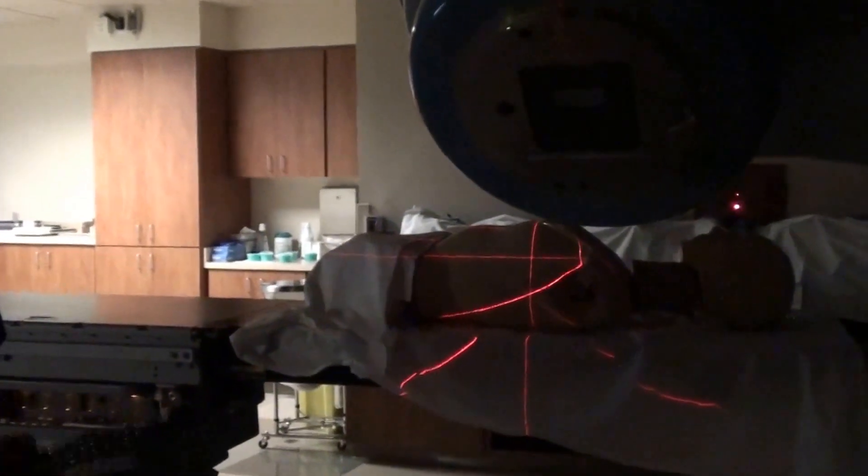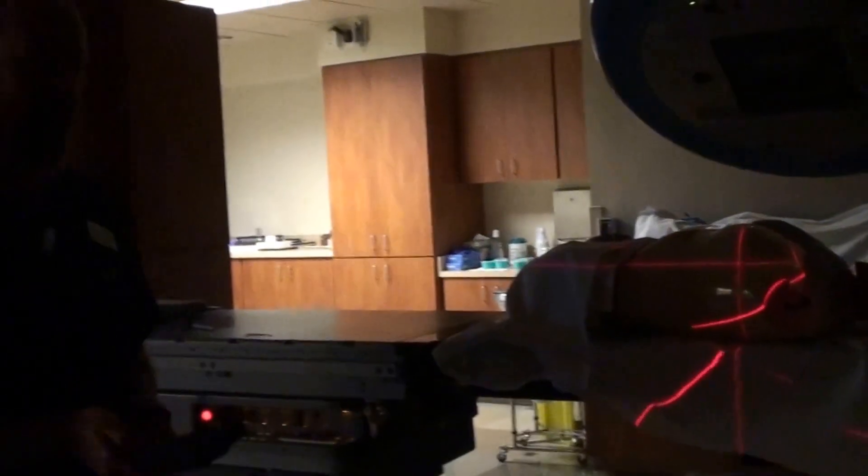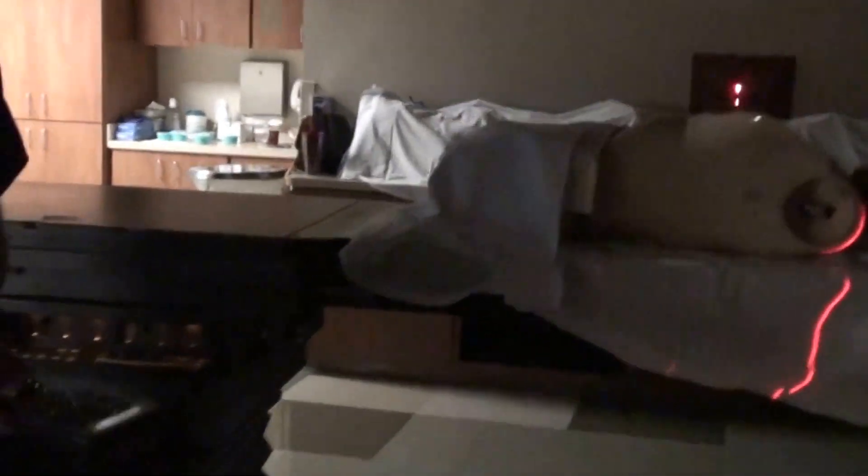When we rotate back around to the lateral tangent — which I'm not going to do right now, as you don't want the gantry in your way — you're going to mirror your table.